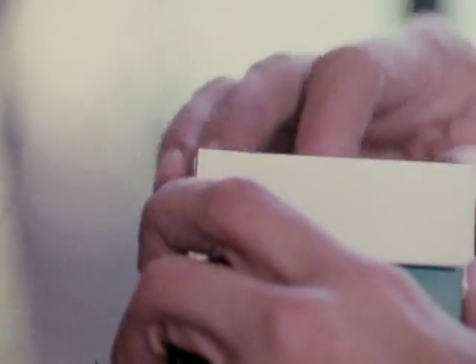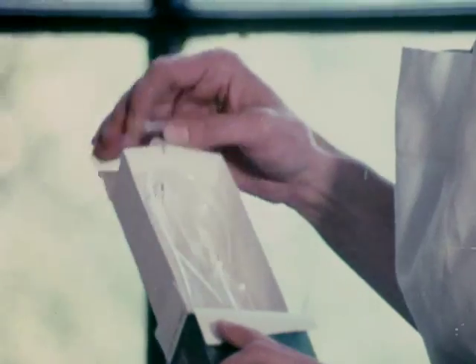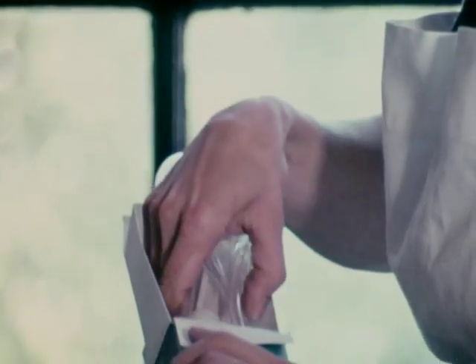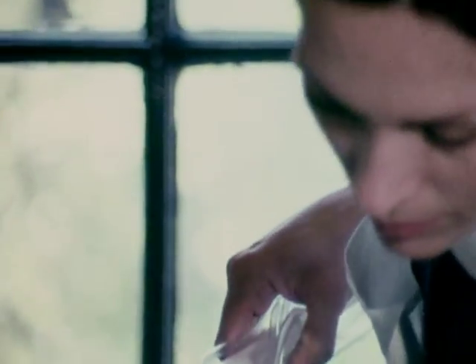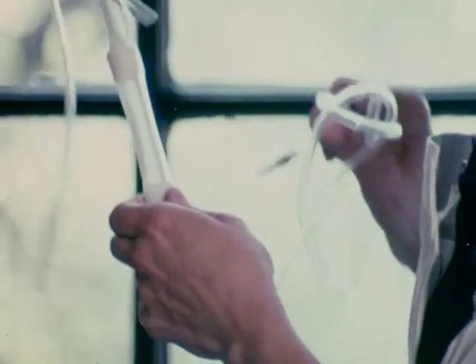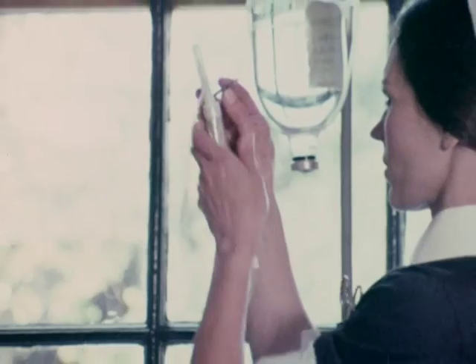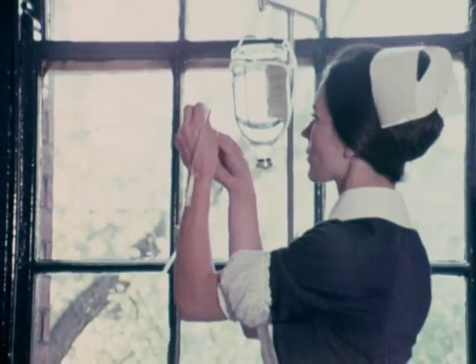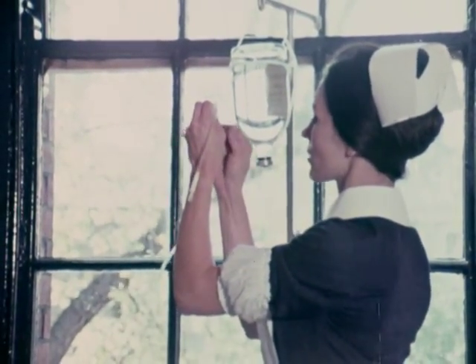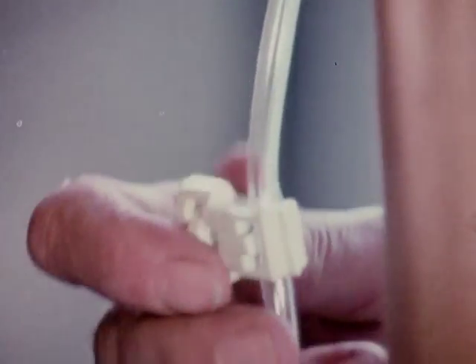This is relatively easy, and as such, is usually handled by a nurse. There are many types of drip set available, but the most frequently used is the administration set for the infusion of blood or solutions. The procedure is simple enough. After the set is removed from the container, close the clamps and push the cannula through the bung of the solution container.